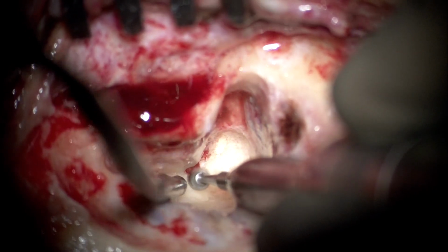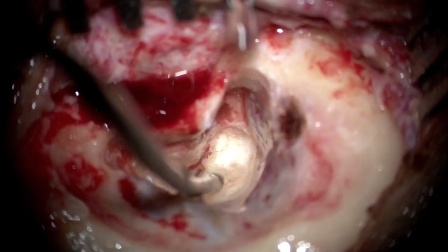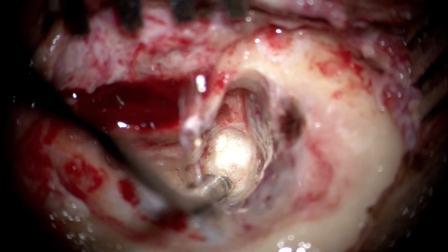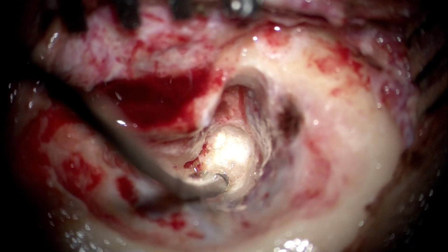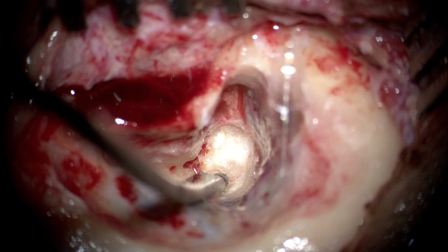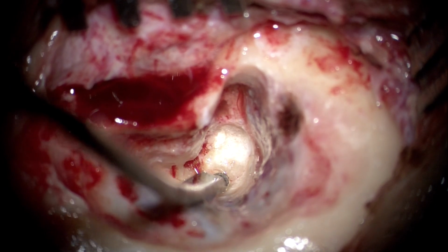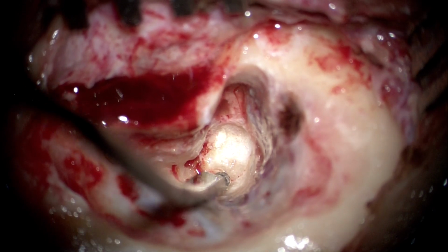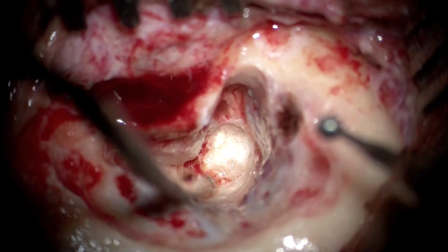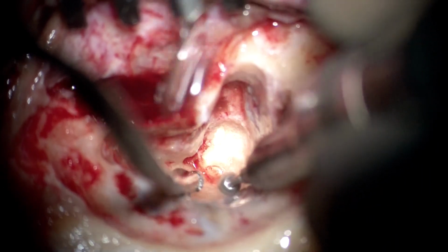We can see here how the vestibule is being opened slowly and steadily. The labyrinthine block, apart from the posterior ampulla, is completely open and drilled. Our goal is to completely drill out the semicircular canals, open the vestibule, and completely remove the sensory neuroepithelium from the vestibule.